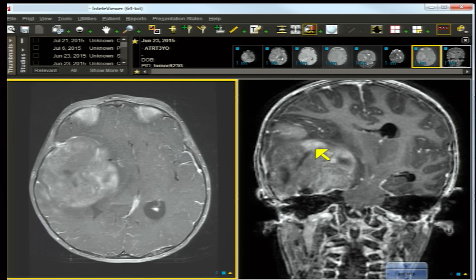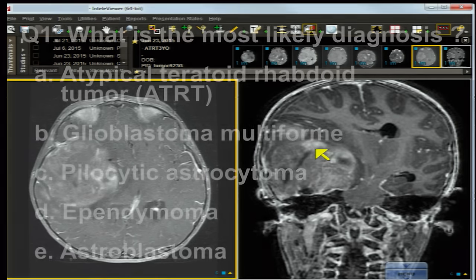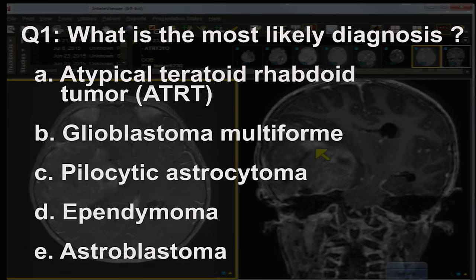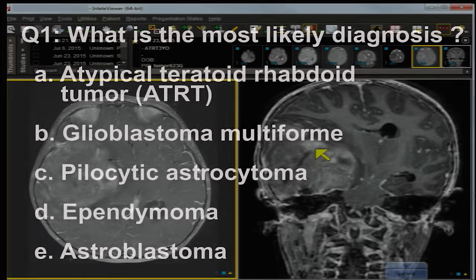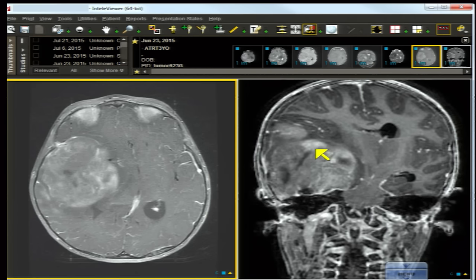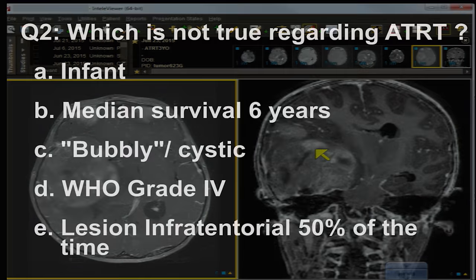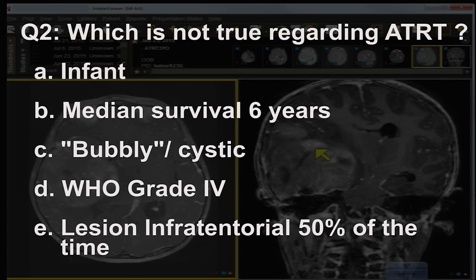Let's tackle our questions. What is the most likely diagnosis? Is it: A) atypical teratoid rhabdoid tumor or ATRT, B) glioblastoma multiforme, C) pilocytic astrocytoma, D) ependymoma, E) astroblastoma? Moving on to question two: which is NOT true regarding ATRT? A) infant, B) median survival six years, C) bubbly or cystic lesion, D) WHO grade four, E) lesion is infratentorial 50% of the time.